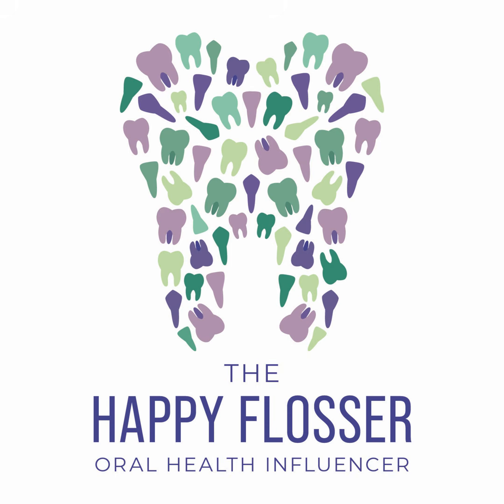Now, the way I tell students to make sure that they get a nice impression, when you mix the alginate, make sure that it's nice and smooth, that it's not lumpy at all, it doesn't have any powder still. Think about when you make brownies or cake. You wouldn't want to have powder in your brownies when you pour them into the pan to go in the oven. Same is true when you're mixing your alginate. Make sure that it's nice and smooth, there's no lumps. You're going to use that vigorous spatula method and kind of push the impression material against the bowl to have the bowl help you mix it so that it's nice and smooth.